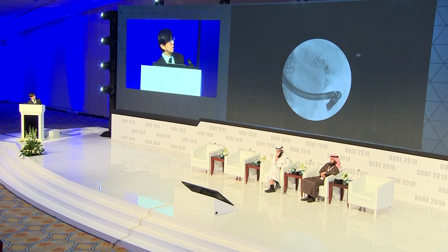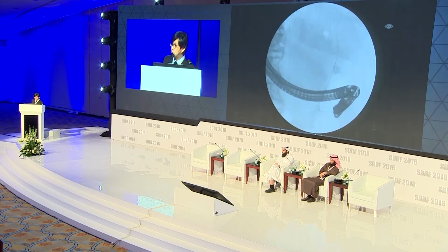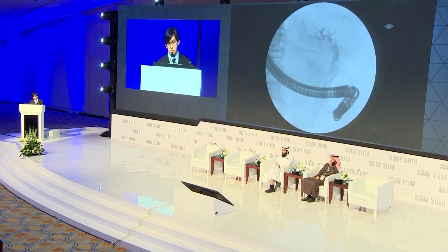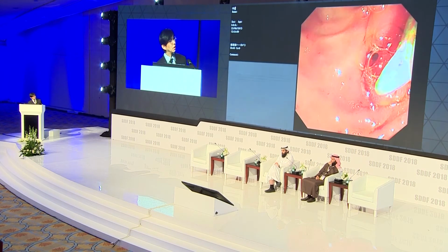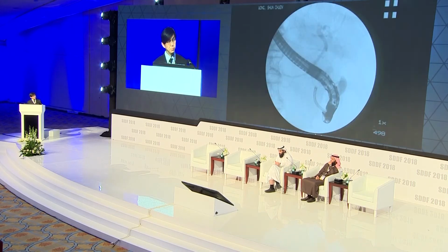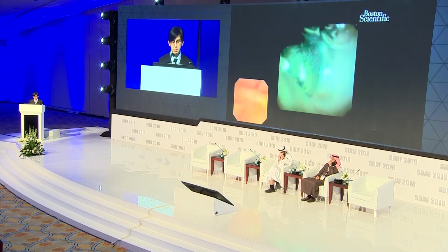This is one such case. You can see, please play the video. And this is a case with a stone impacted at the confluence of the cystic duct and the common hepatic duct. You can see just on the plain film, the stone does not really move. So the spyglass was used, and we used a holmium YAG laser.